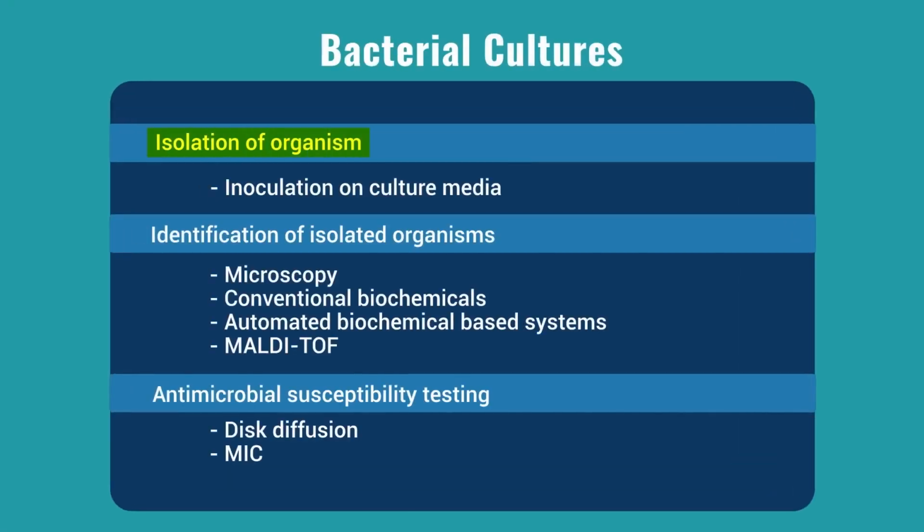Let's now try to understand bacterial cultures. This is a very frequently asked investigation. There are certain processes which are involved in finally giving out a report of a bacterial culture. First, we need to isolate the organism.